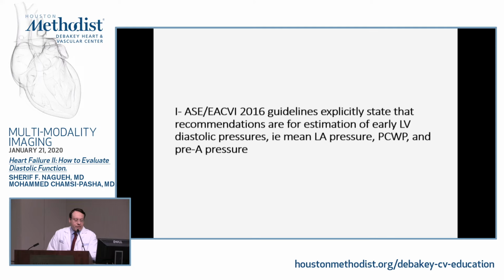To that effect, guidelines were published by the joint publication by the American Society of Echo and the European Association of Cardiovascular Imaging in 2016 towards the guidance of how to look at diastolic function and to estimate filling pressures.